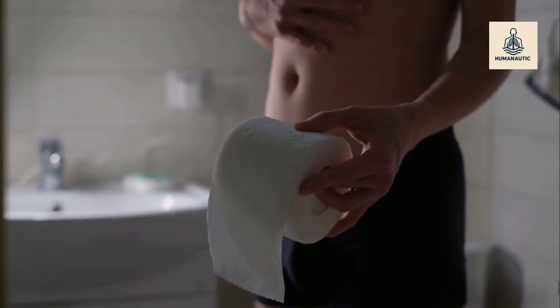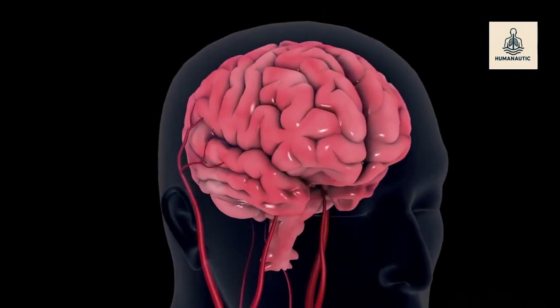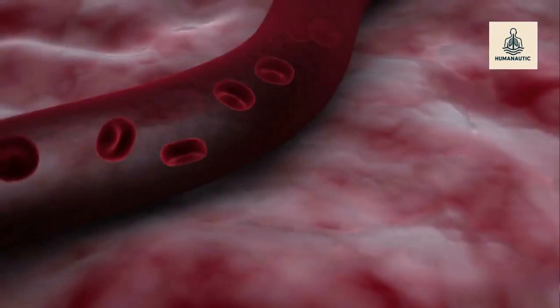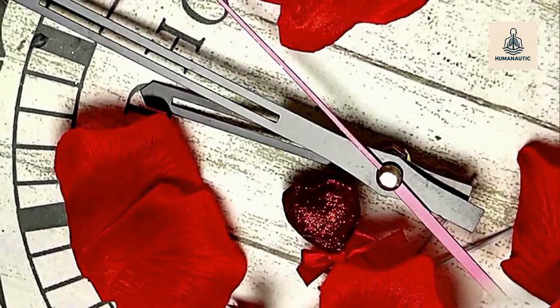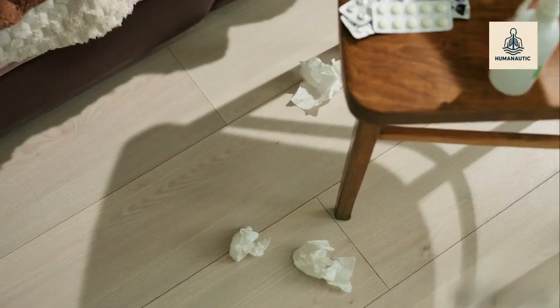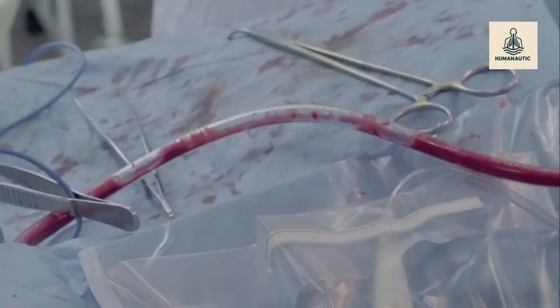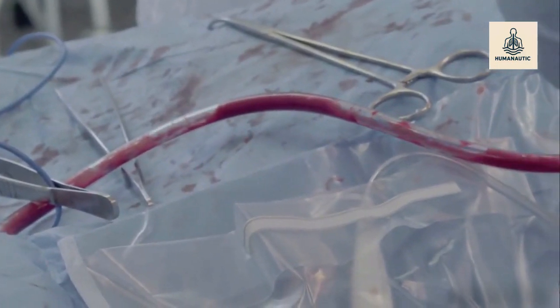4. Identification of hemorrhoids. The main hemorrhoidal cushions are commonly located at 3 o'clock position, 7 o'clock position, 11 o'clock position. These are the typical sites where internal hemorrhoids develop. The surgeon identifies the most symptomatic hemorrhoid first.